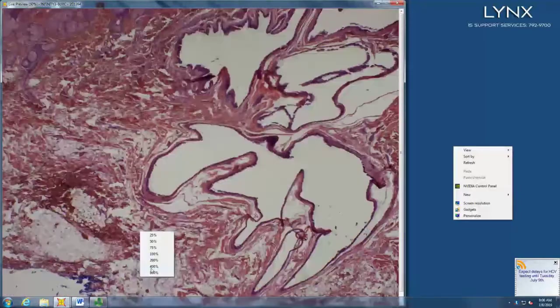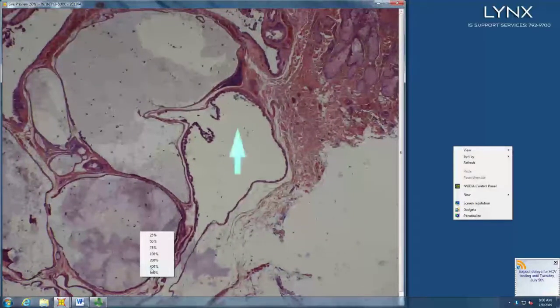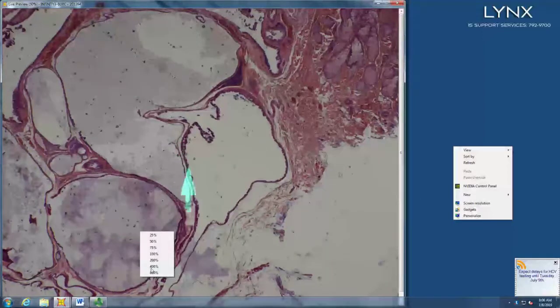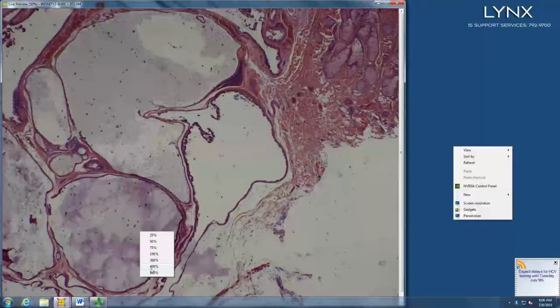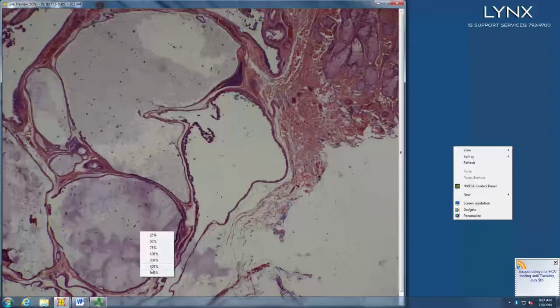Alright, so we have some cysts, a lot of cysts. Is that apocrine snouting? There's apocrine snouting and Roman arches. So there's schmutz in there. It's not like a median raphe cyst, is it? So probably not. This is more the way apocrine sweat gland looks. Okay. So like hidrocystoma. Yeah, and so what would be a hidrocystoma that's becoming an adenoma would be a cystadenoma.